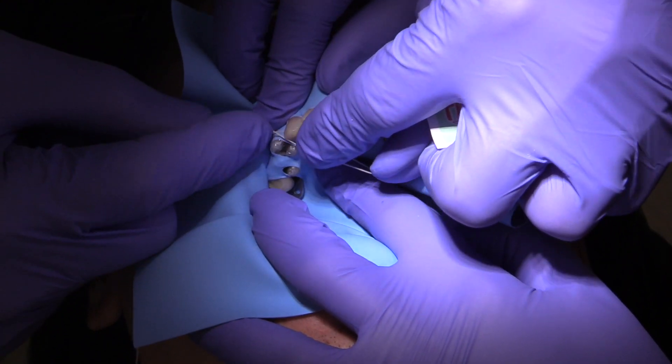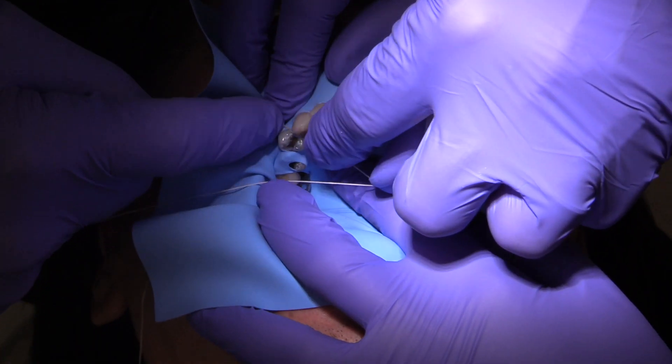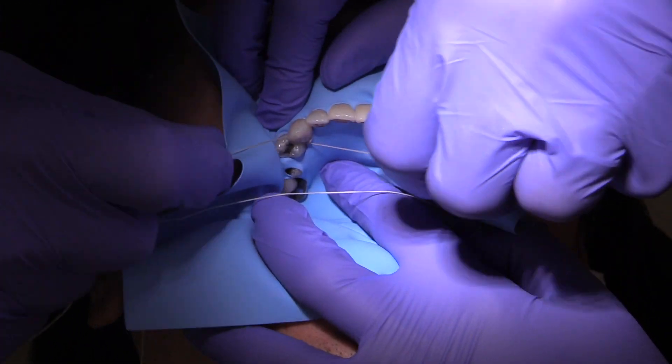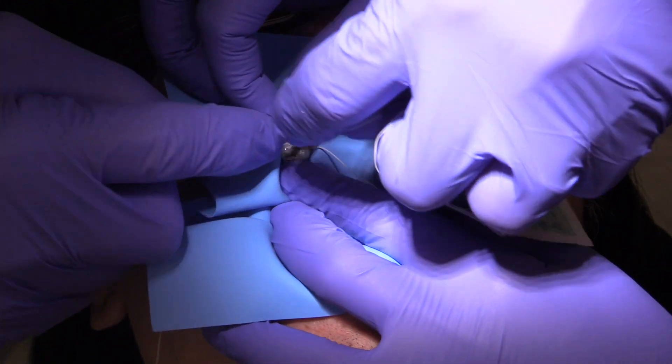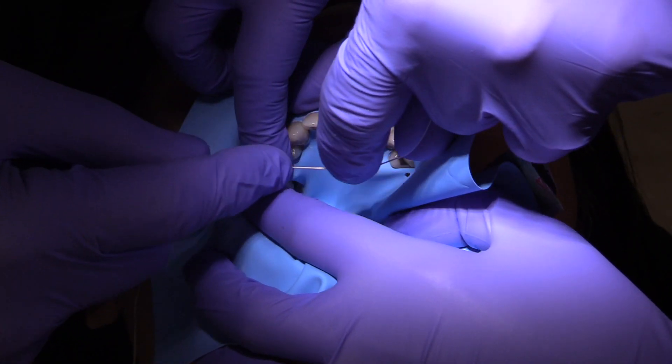Oftentimes I can place rubber dam without even using any dental floss. And there you go — I think that placement of that interproximal between five and six was a really good example.